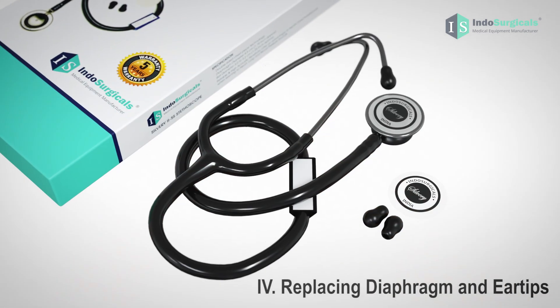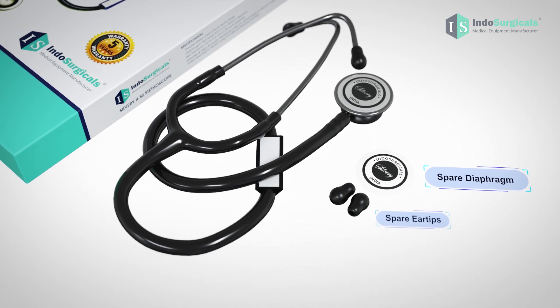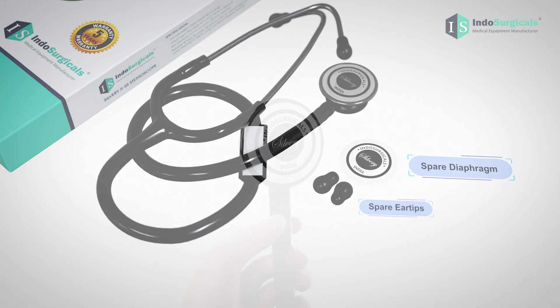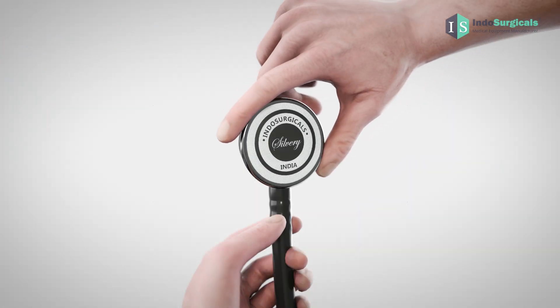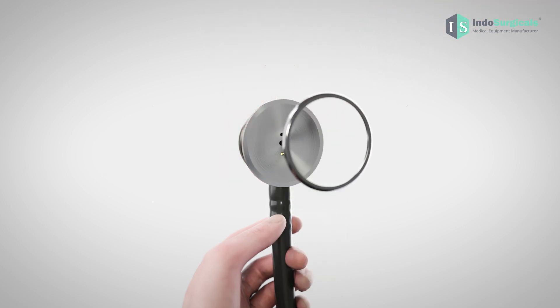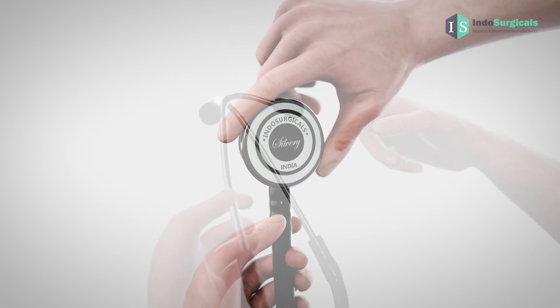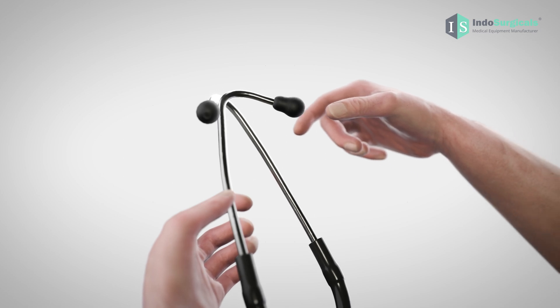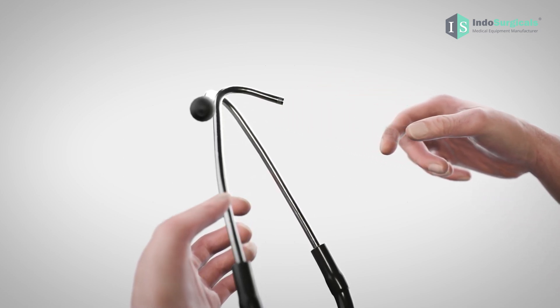The Indosurgical Stethoscope comes with one spare diaphragm and a pair of ear tips. If you need to replace them, follow these steps. To change the diaphragm, rotate the diaphragm retaining ring anticlockwise, remove the old diaphragm, and replace it with the new one. For ear tip replacement, simply pull the existing ones outward and insert the new ones.